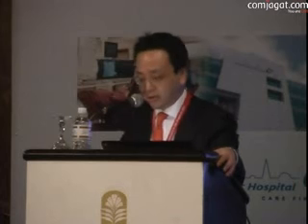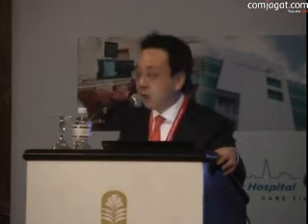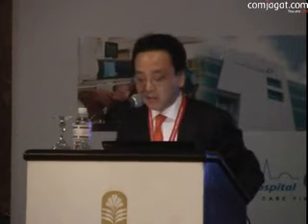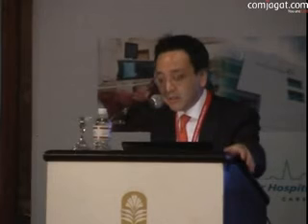A national university did a recent meta-analysis of all the 6 randomized trials and the 3 registries that compared the second generation drug-eluting stent with the current standard. From this data, we see that regarding cardiac death, there was no significant difference between the 2 stents. However, from myocardial infarction onward, there starts to be a slight difference. There's marginal significance of the reduction for myocardial infarction with the second generation DES.